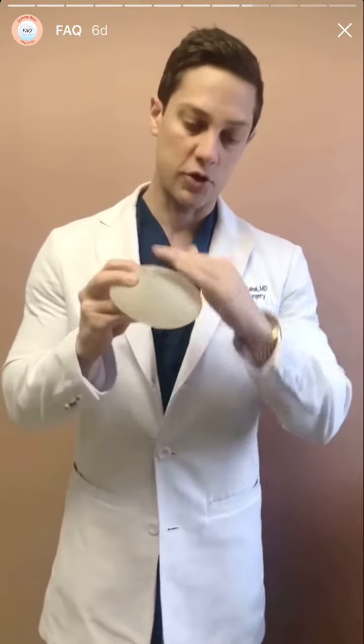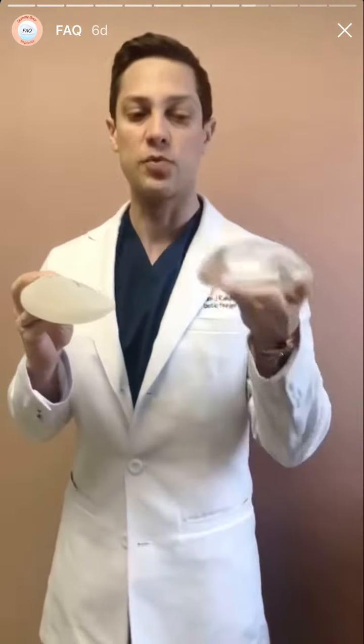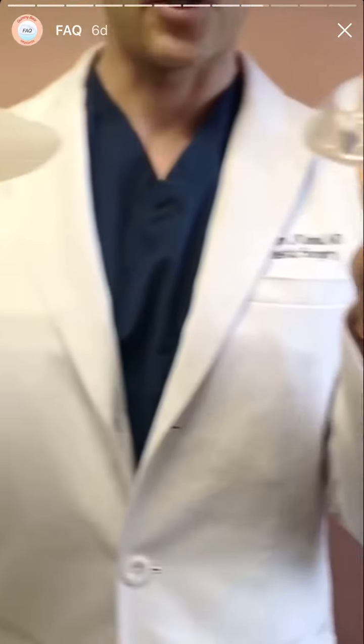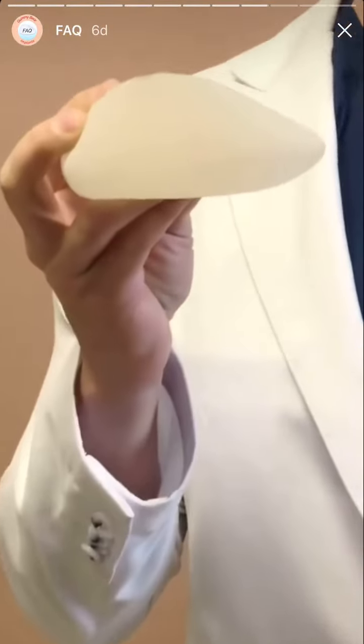Malrotation happens about 2% of the time. That means the implant flips. So that's the number one thing patients aren't too excited about. The second thing patients should know is that it's a textured implant. Texturing refers to the surface. This has a very smooth surface, that's why it's called a round smooth implant. This has a textured surface, kind of like sandpaper, where it's rough. That texturing process allows the implant to stick down to the chest so that it doesn't rotate. That's the reason they texture it.